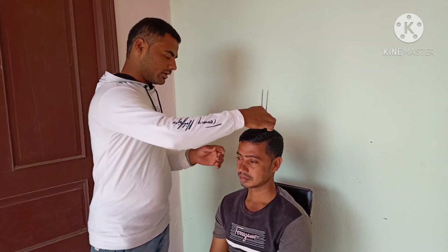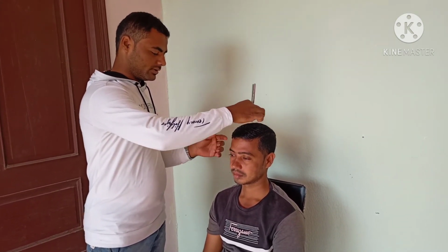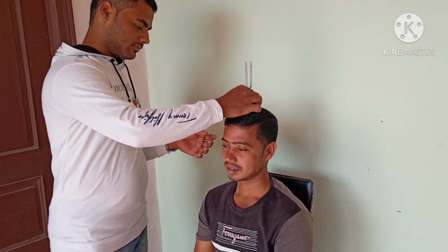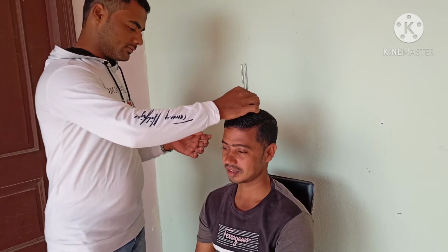Put the vibrating fork on the top of the head of the patient. Now perform the Weber test. Ask the patient if there is a louder sound in one ear or both ears with the same sound.